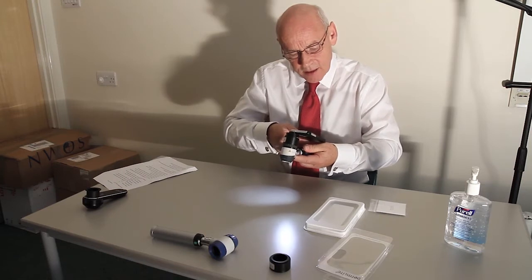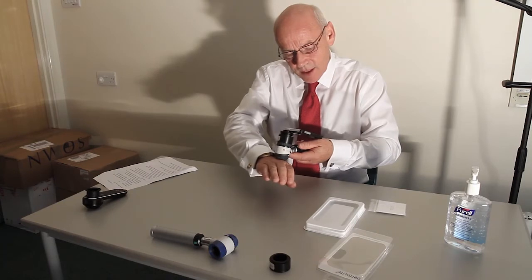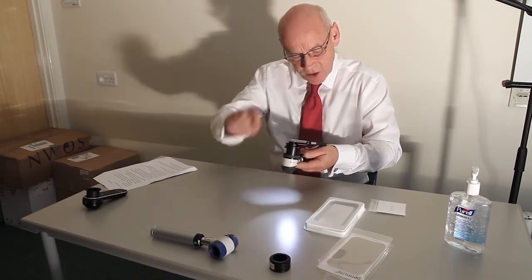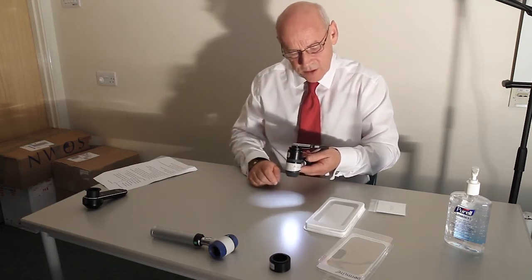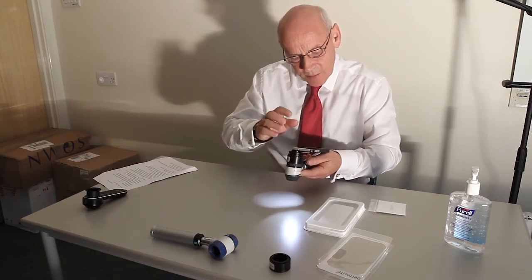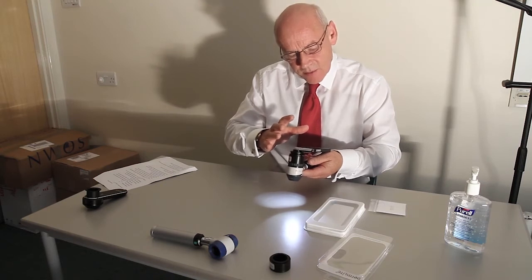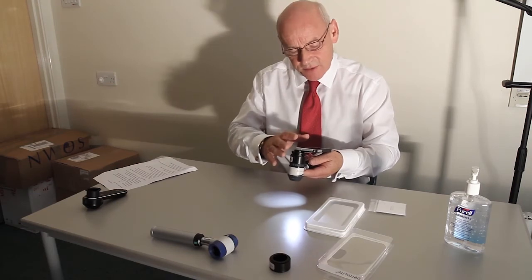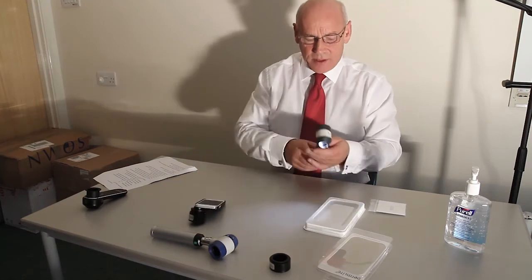Get it nicely lined up. Open it out a bit more. Get it to the point at which it's showing the lesion that you want to show, and then in that position you just take the photograph. If it's not in focus, you can actually touch the screen, but it does change the white light and makes it a little bit darker. So the image might be better in focus. I take 2 or 3 photographs so I can choose the one I think is the best in focus and looks the best. So that's taking it with the Heine Delta range.